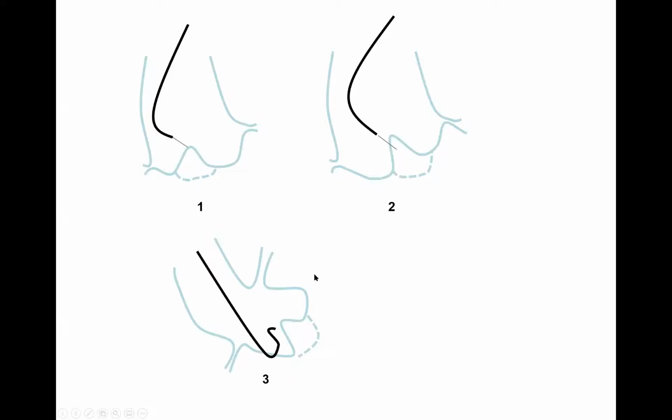This is another example of various anatomies of the aortic cusp. Those are interesting because you're not seeing the aortic cusp, you're imagining it. So you need to kind of be able to imagine the anatomy. This is particularly relevant in aortic stenosis. And based on the anatomy of the ascending aorta and the anatomy of that cusp area, depending how straight, horizontal, or vertical it is, and most often it is close to number 3. In most elderly anatomy, your anatomy is mostly number 3. Your aorta is elongated and flat, and the cusps are vertical.